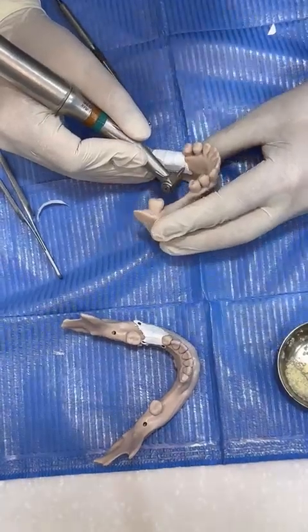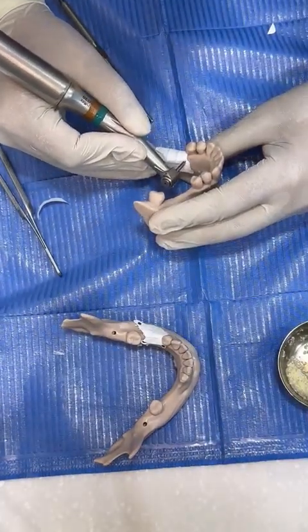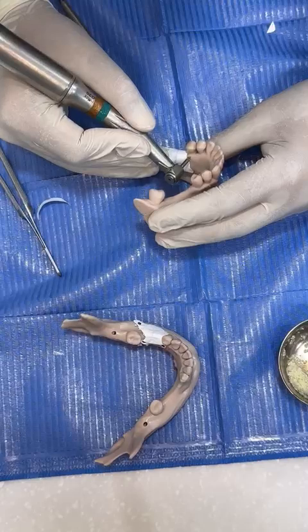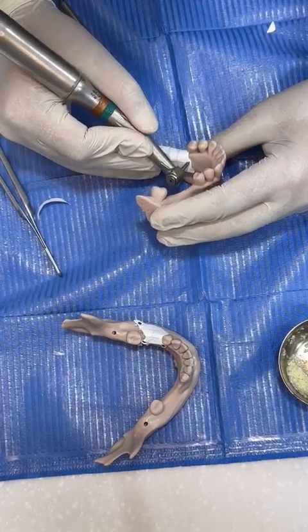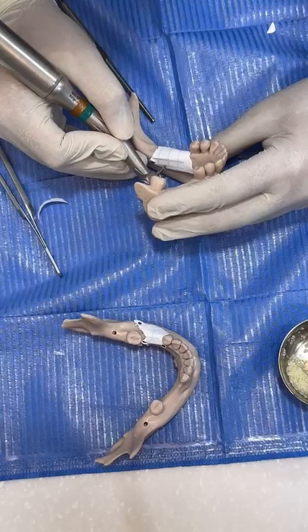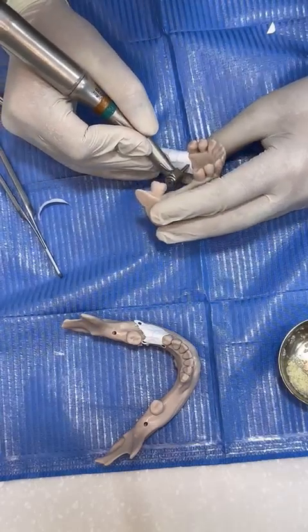I will fix here. No need to extend the membrane too much behind the last tooth from the lingual side. And I'm going to fix here, and this excess, most probably I will cut them in the end.